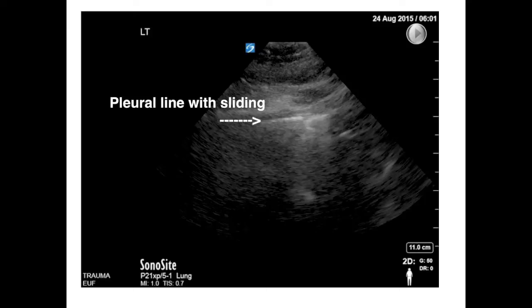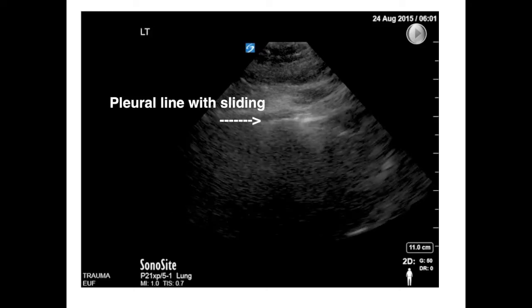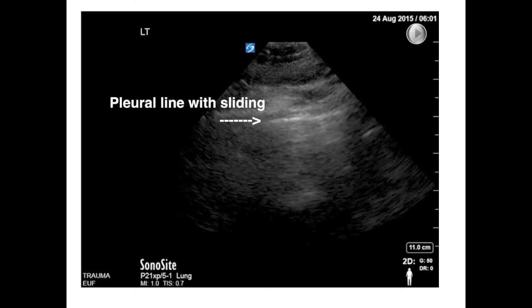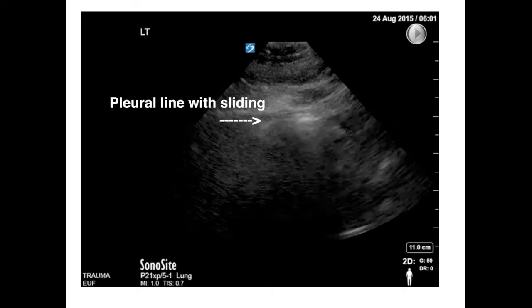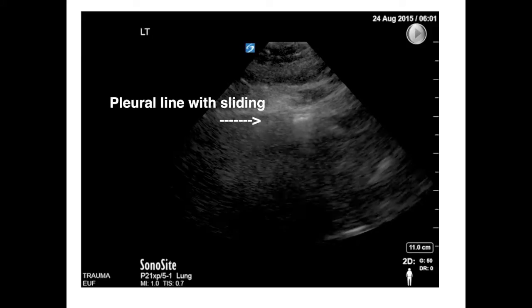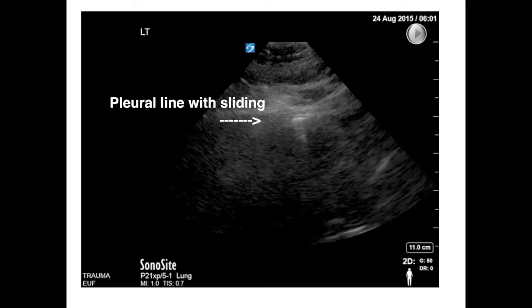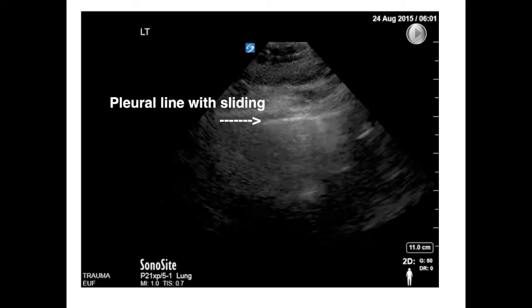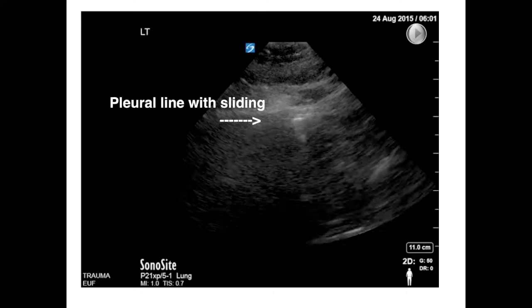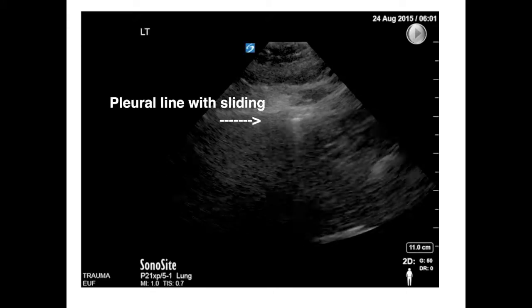But more importantly for us is to just visualize the lung sliding. In today's world, we can save these clips and view the clip, so we much prefer saving clips rather than still images, although at some facilities you may still have to save M mode to show someone a 6-second clip. In this clip, you see lung sliding as the patient is breathing.